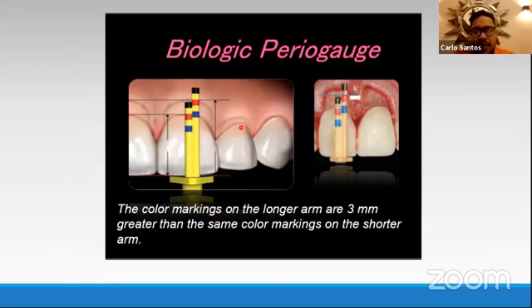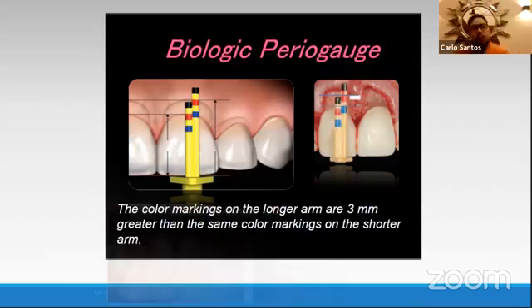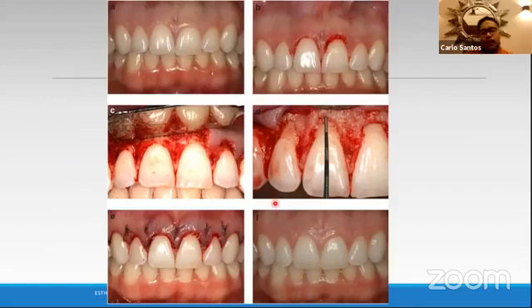It's like using your forceps for extraction. Can I use this? As long as the physics is correct, the philosophy, the principle, that's why we have principles in surgery. It's a must to follow this. So in doing your incision, you can use anything as long as the principle is correct. Okay, so now we do the step by step in doing our aesthetic crown lengthening.